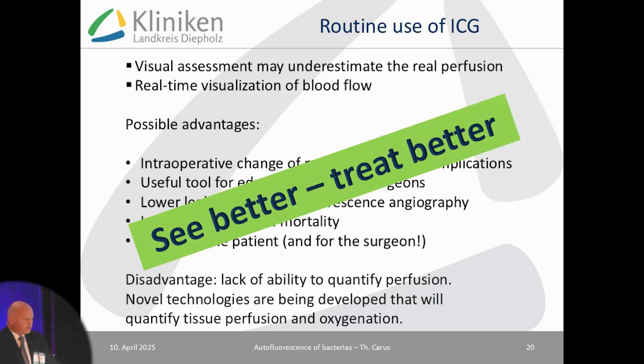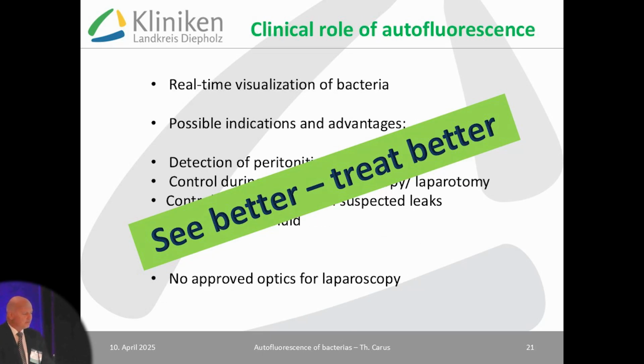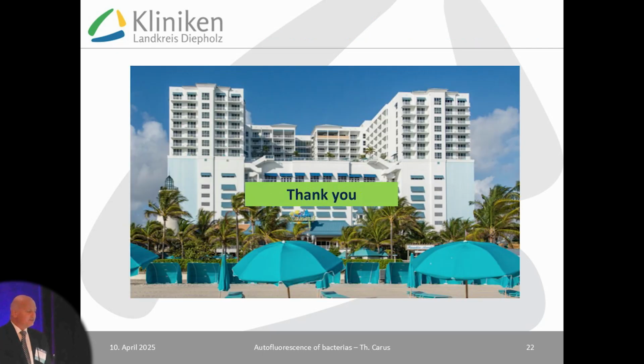Last year I stopped with this slide, routine use of ICG in colorectal surgery, and my conclusion was see better, treat better. And I can transfer this to this year for the clinical role of autofluorescence, the same: see better, treat better. And thank you so much.